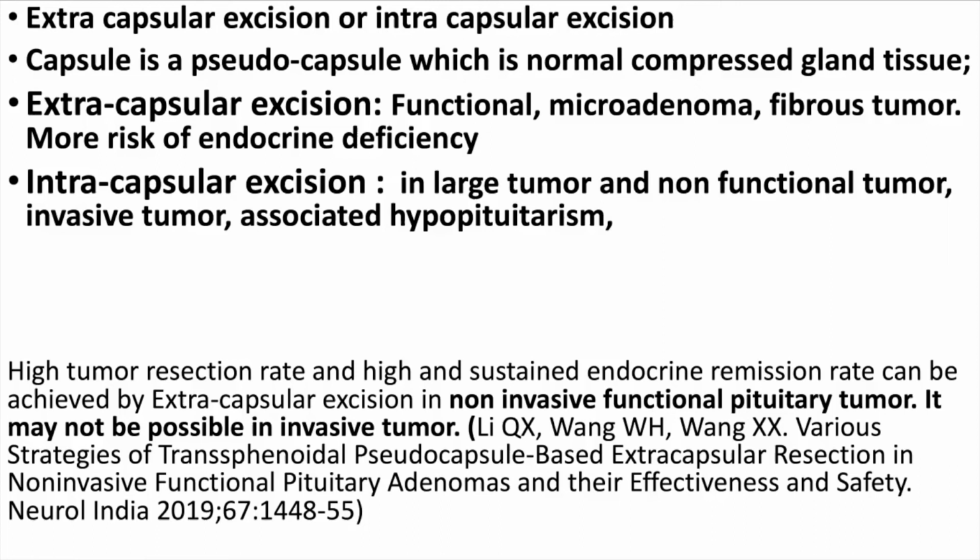not that in every case you go for only extracapsular or intracapsular, or one can go for both intracapsular and extracapsular. Initially you can go for internal decompression, and when the tumor has become small, then you can go all around and do extracapsular excision of the lesion.